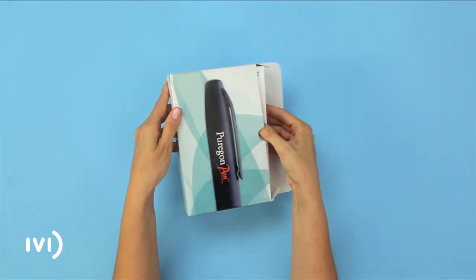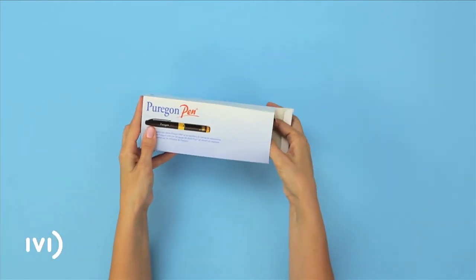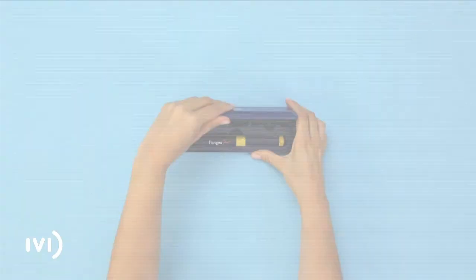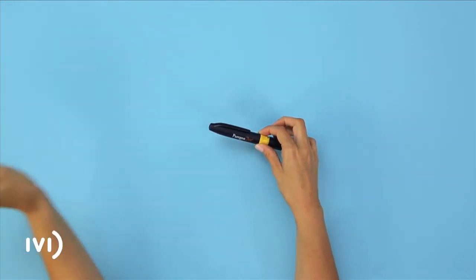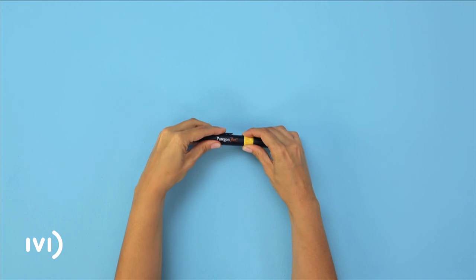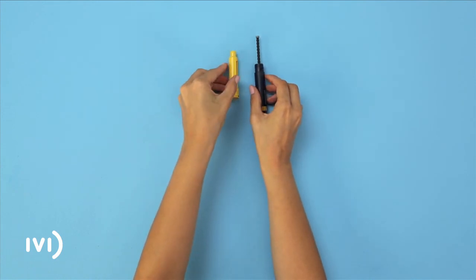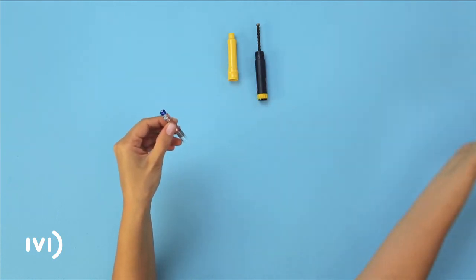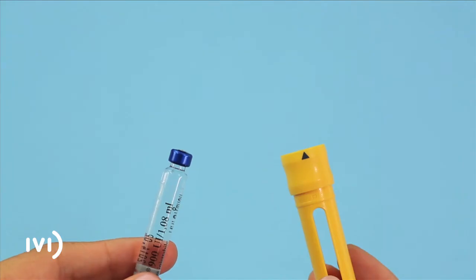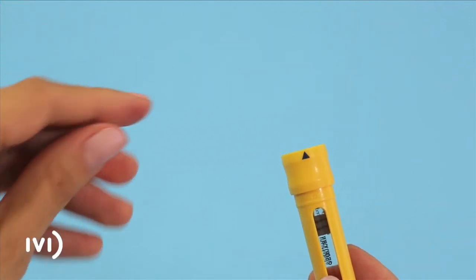Take the box of Puragon pen and remove the contents. Take the pen out of its case and take off the lid. Screw open the pen as shown and set it aside on the table. Open the box of medication and take the Puragon cartridge.